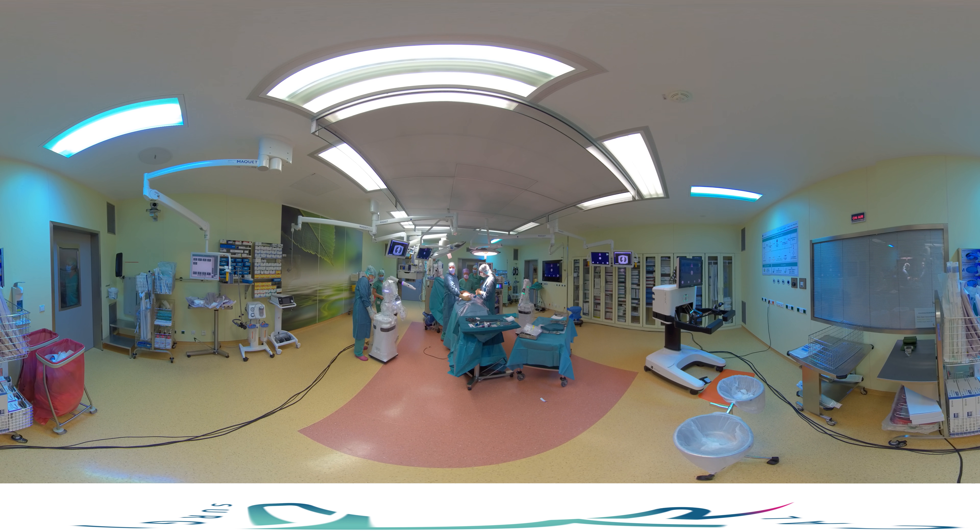Once the bedside units have been draped, they can be moved next to the patient, ready to start the surgery.